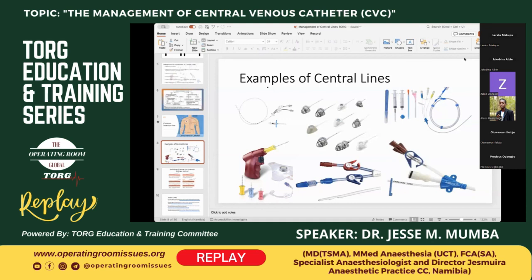So you create an AV fistula for dialysis and you put in a permanent catheter. While the fistula is maturing, the patient can use that. It normally takes about 90 days, which is 3 months, for the fistula to mature for it to be used. In that case, they'll still be using this line.